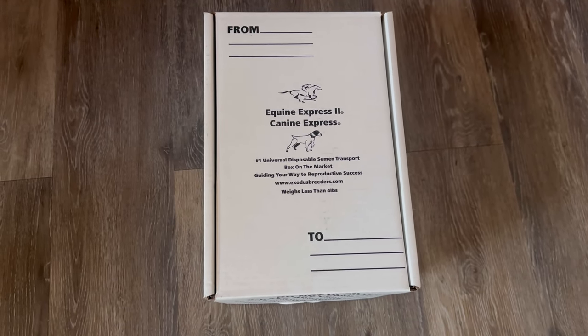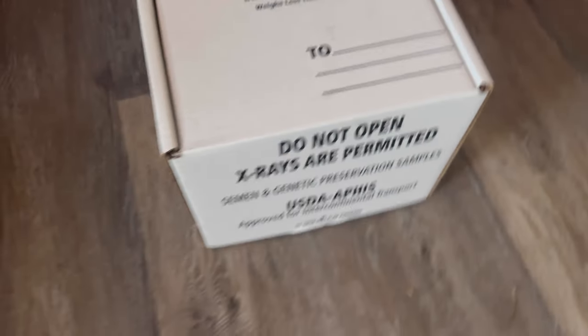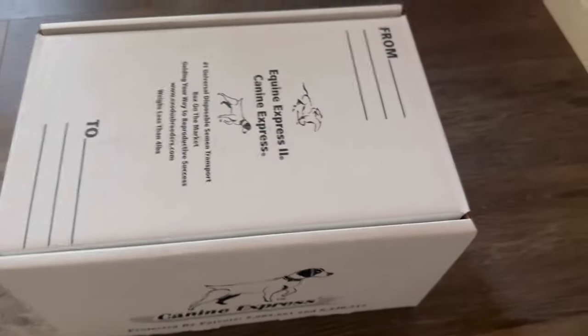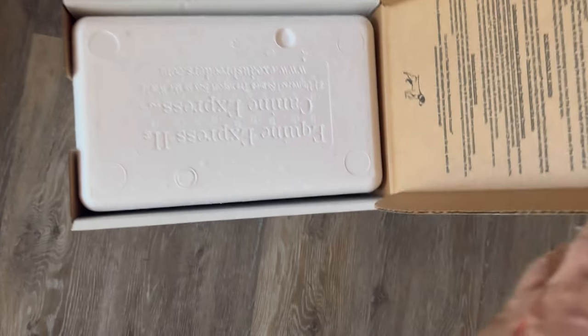Here is the K9 Express. We're going to open this thing now. This is what we have inside.